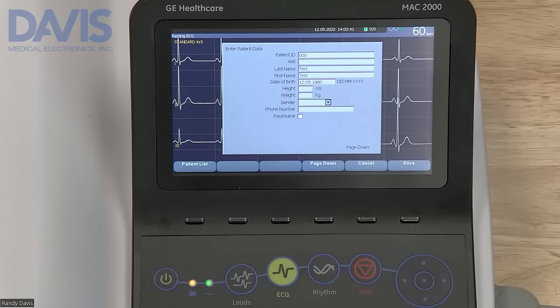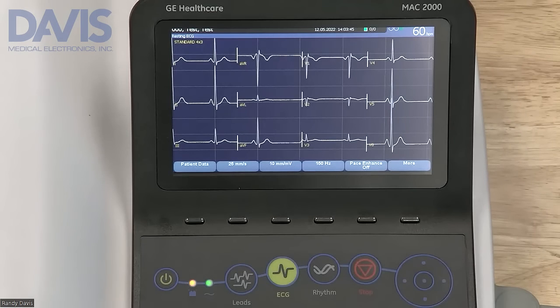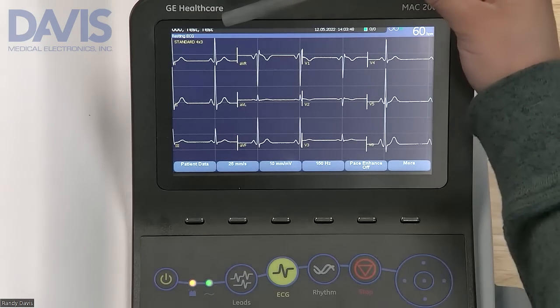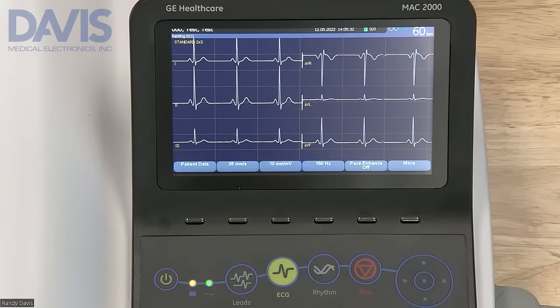Once you have entered patient information, click the save button. The patient's name will show up on the top of the screen. Use the lead key to scroll through your different display options.